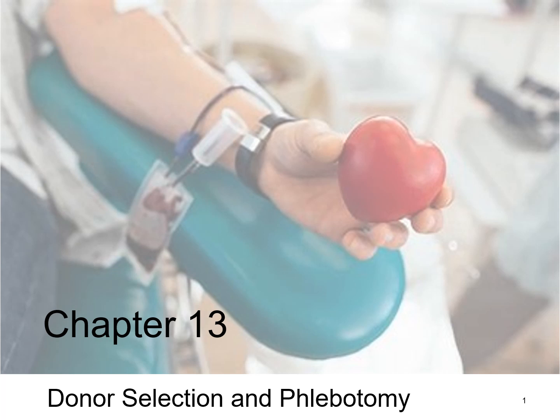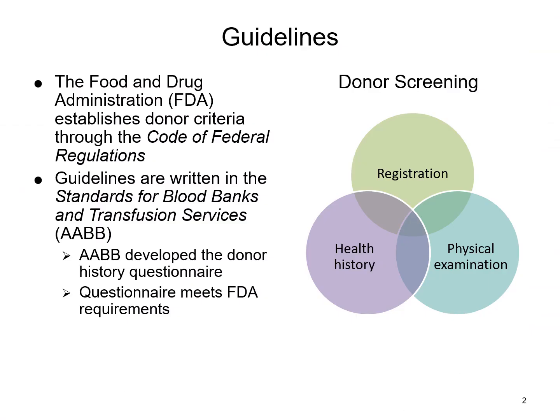For this lecture, we will discuss Chapter 13, Donor Selection and Phlebotomy. So your blood centers or your transfusion services are the ones that are responsible for providing an adequate blood supply for the patients that you serve.